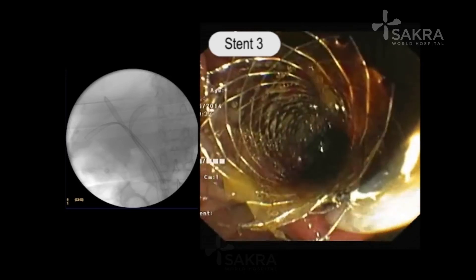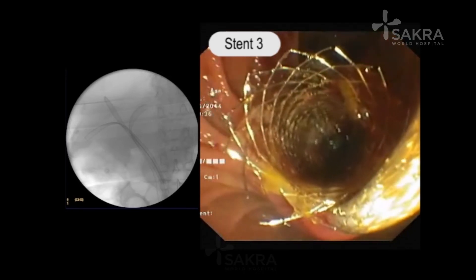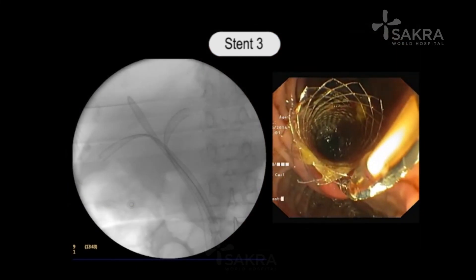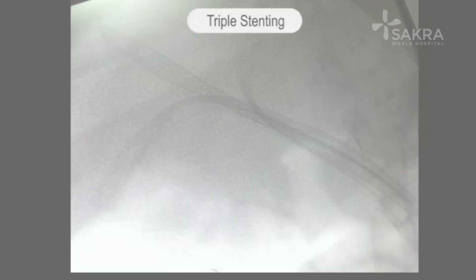The third uncovered biliary metallic stent is now being deployed under endoscopic and fluoroscopic control. At the end of the procedure, all three stents are deployed — two in the right system and one in the left system. This provides good endoscopic palliation for these patients with hilar biliary obstruction.